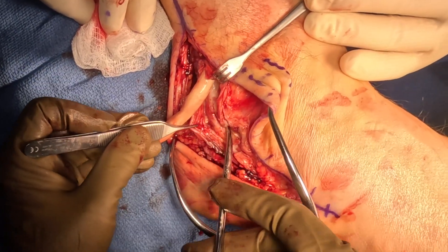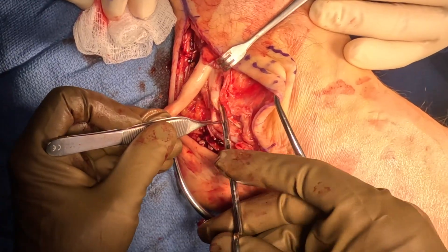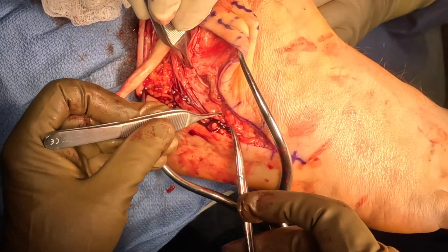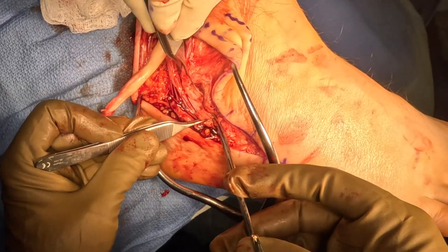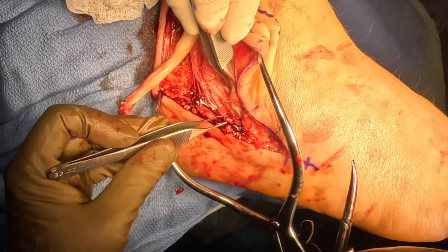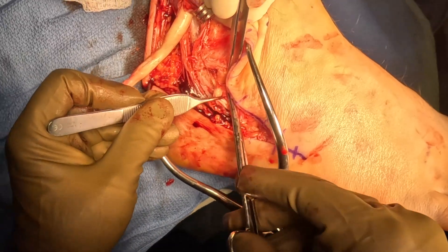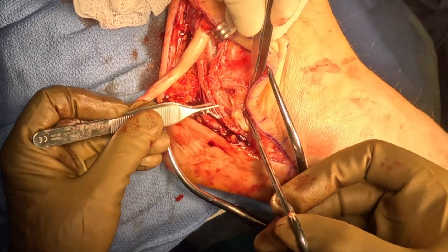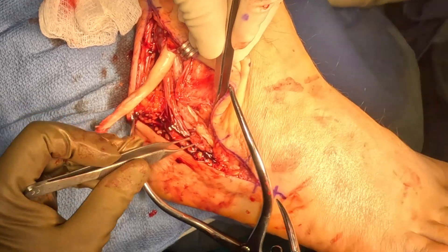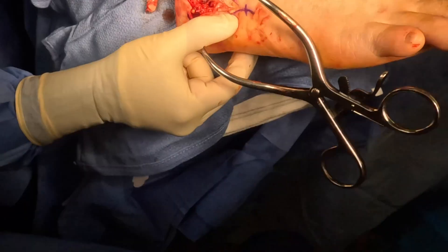Right now, we're still working on dissecting and finding that brevis tendon, pulling it out. You can see here there's complete rupture of those fibers. There's a small portion of the brevis tendon connecting to itself. Watch when we pull this out — you'll see there's only a small fiber connecting that proximal stump to the distal stump of the brevis tendon.